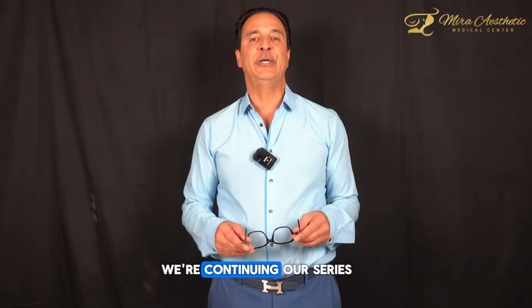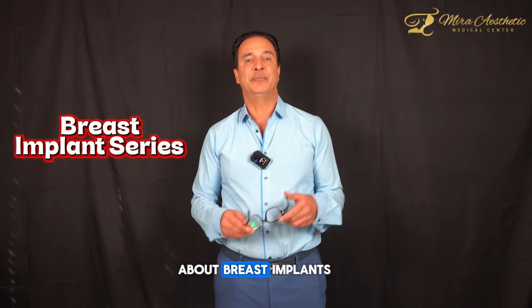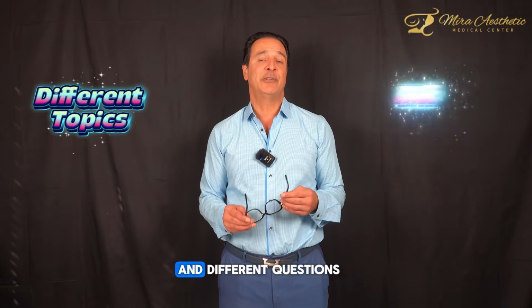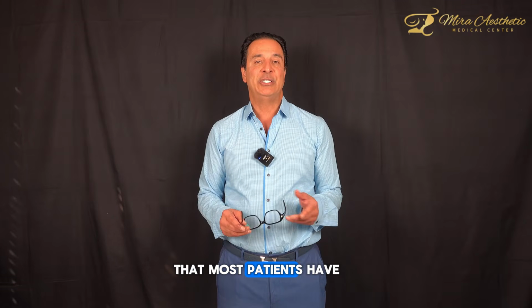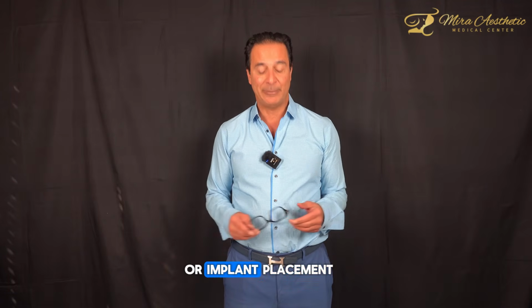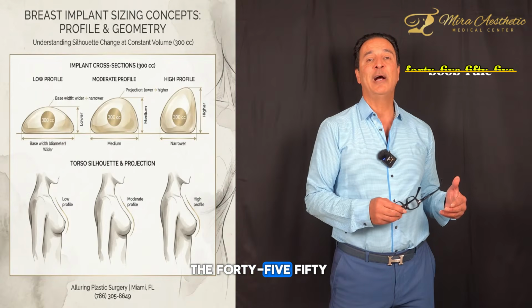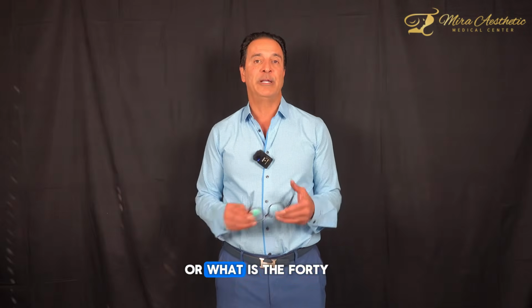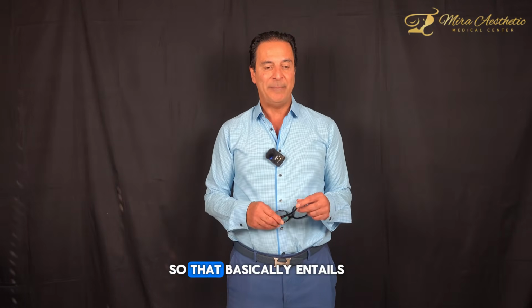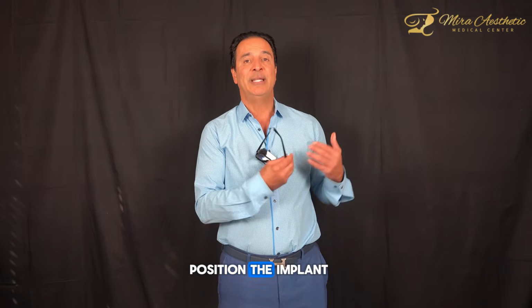We're continuing our series of videos about breast implants or breast augmentation, covering different topics and questions that most patients have about doing an augmentation or implant placement. So the next question is, what is the 45-55 boob rule, or the 45-55 breast implant rule? That basically entails where you're going to position the implant.